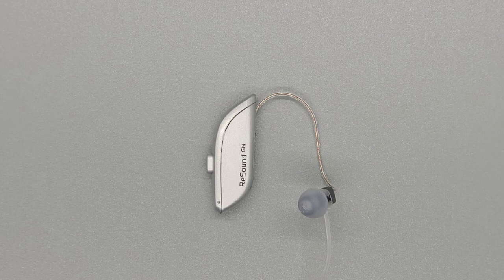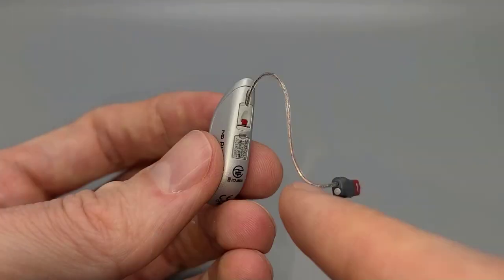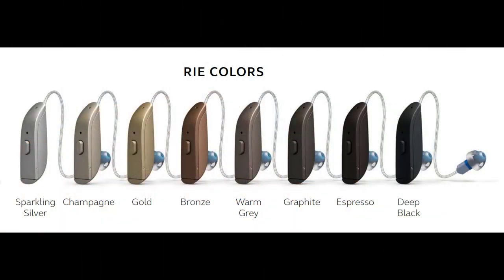A couple of key features you can pick up on right away are their new shape with a distinct point at the top, a new microphone design and placement, an easier to feel push button, and new receiver wire design and attachment. They also have a new lineup of colors. ReSound has definitely taken the approach of matching hair and skin tones, instead of continuing with their colorful reds, blues, and camouflage colors.